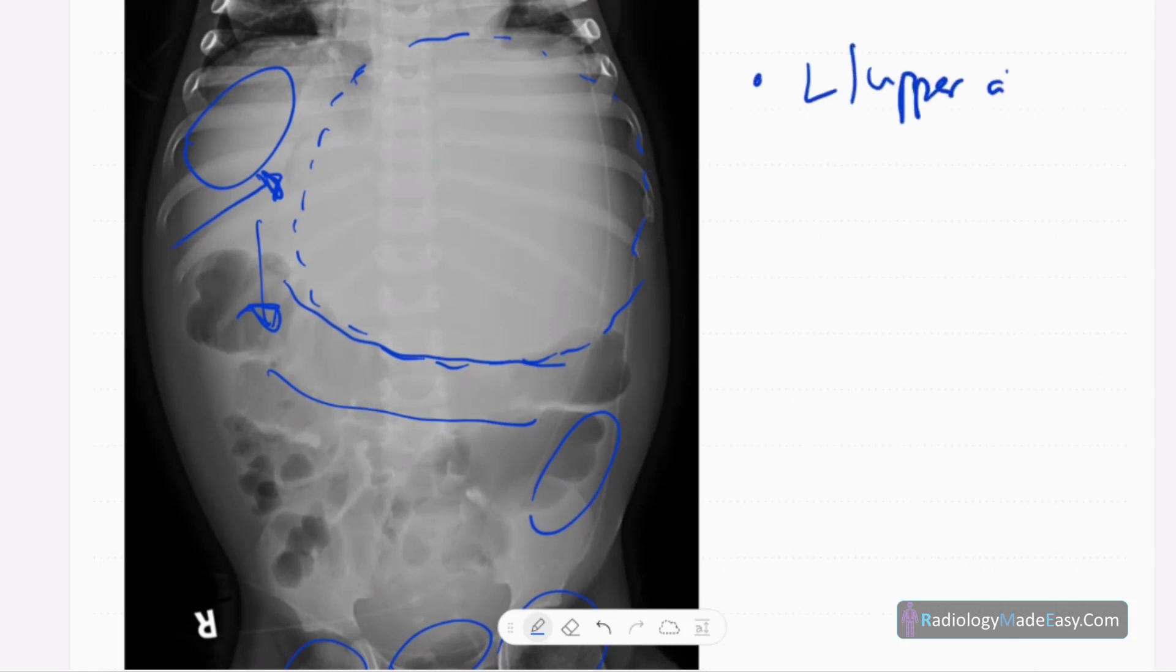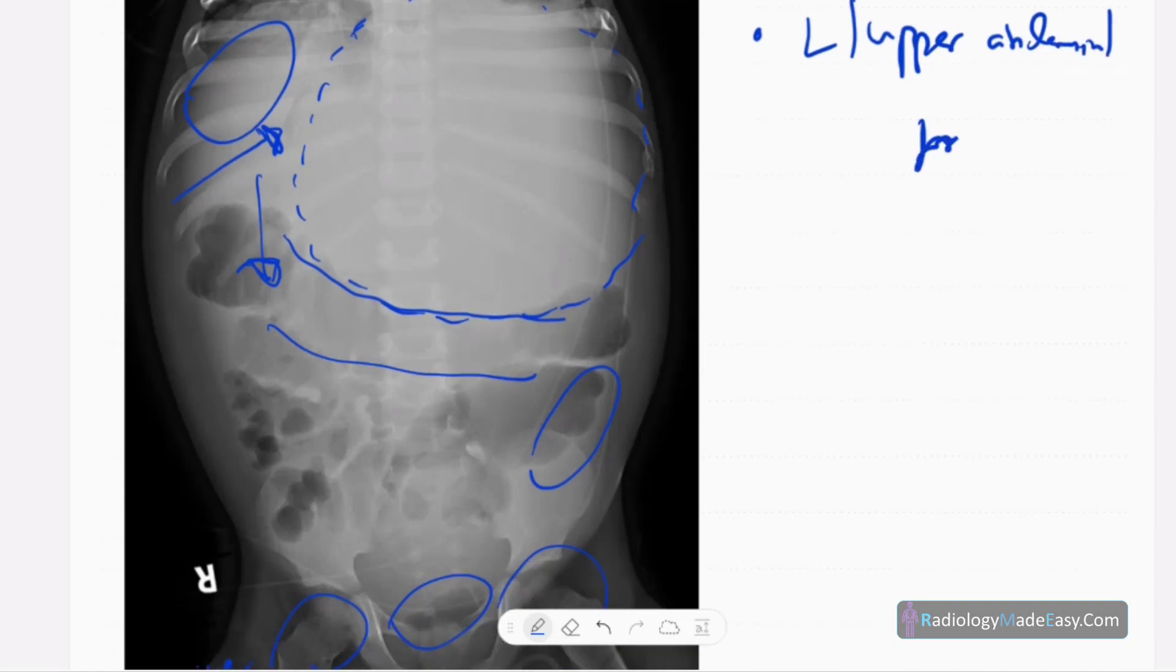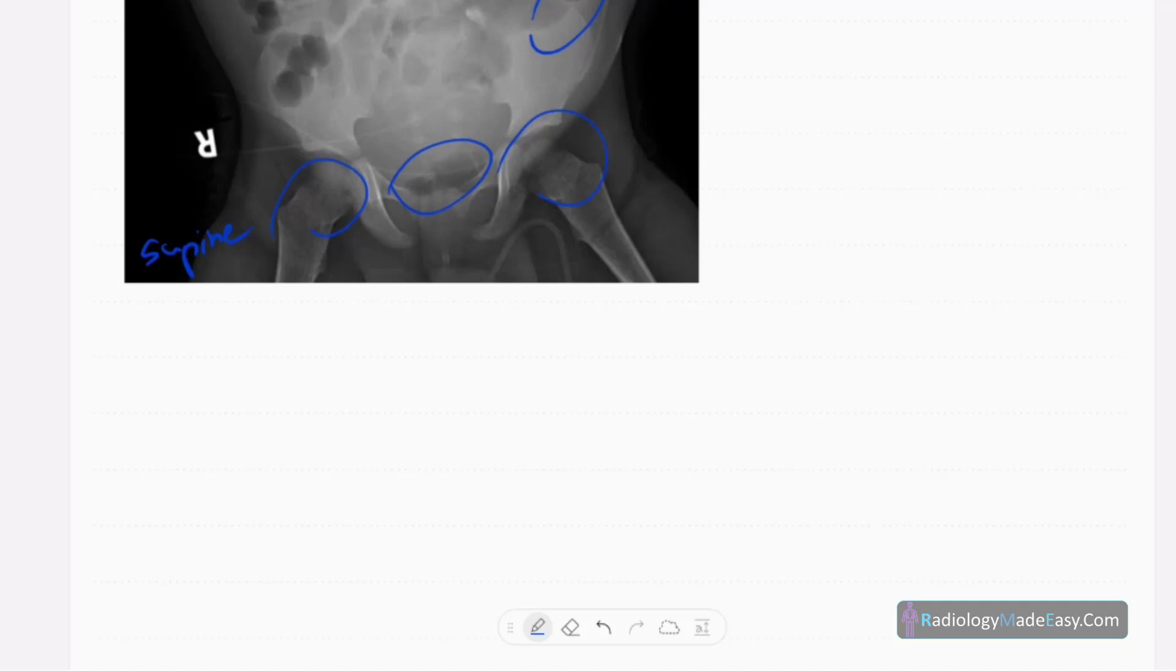So there's a left upper abdominal mass. There are no calcifications in the x-ray. However, in this case, the diagnosis is neuroblastoma.